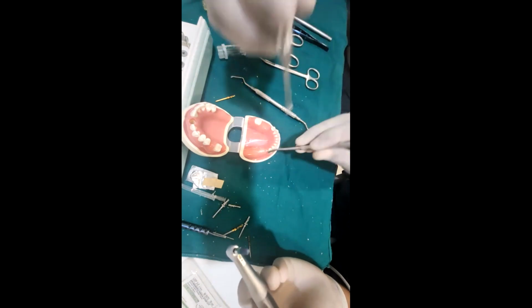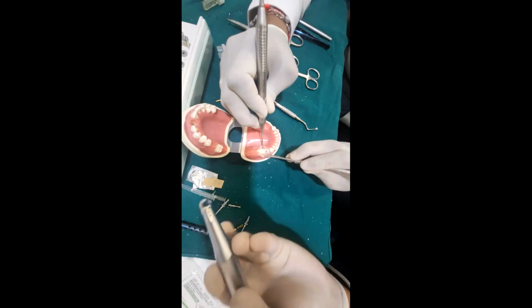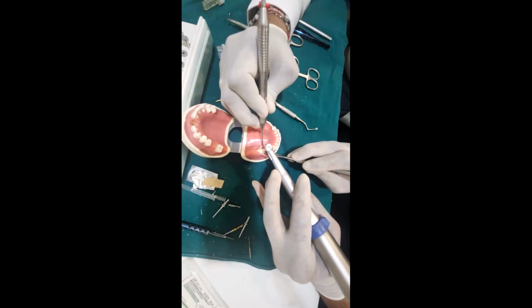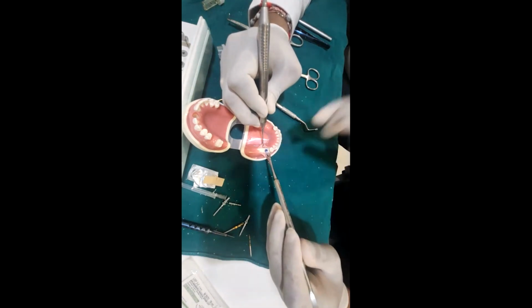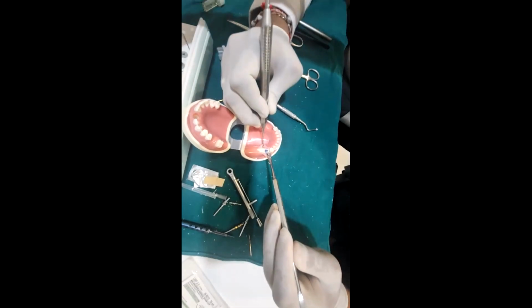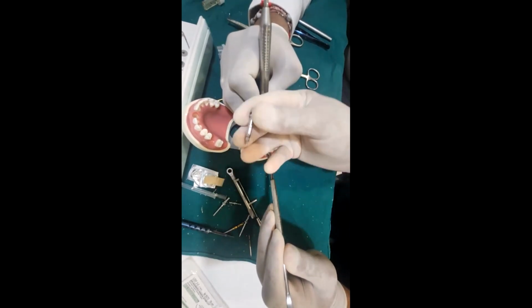So here we start with the implant placement. As I said, keep it facing upwards, never downwards. Ensure there is no soft tissue entrapment. Slowly let the implant go in. Here we have the implant which has torque as far as the handpiece is concerned. So we are supposed to take the hand ratchet, torque ratchet, and the implant level driver.